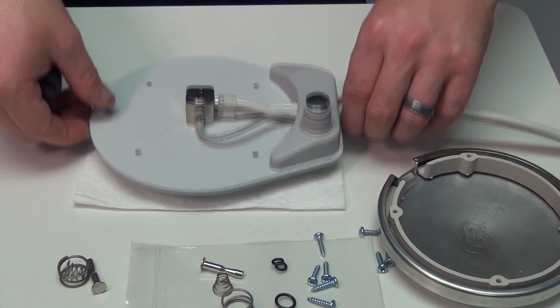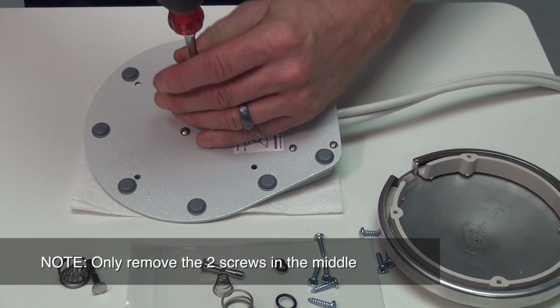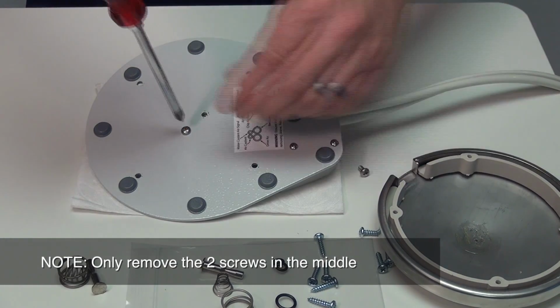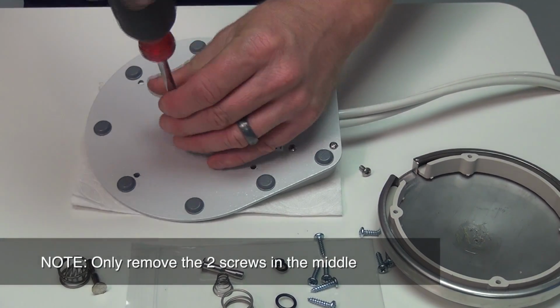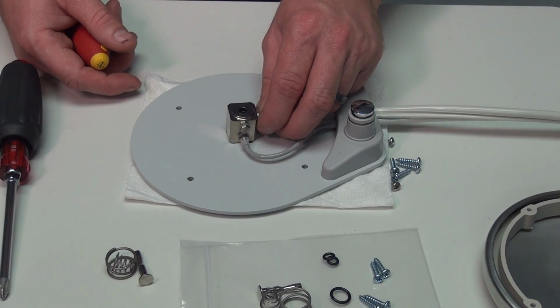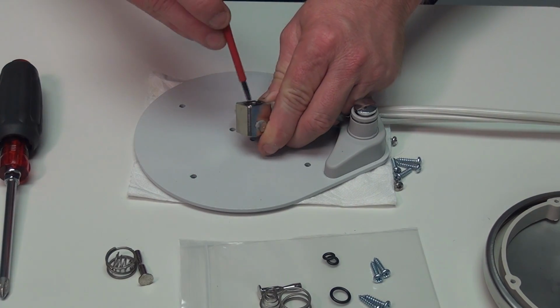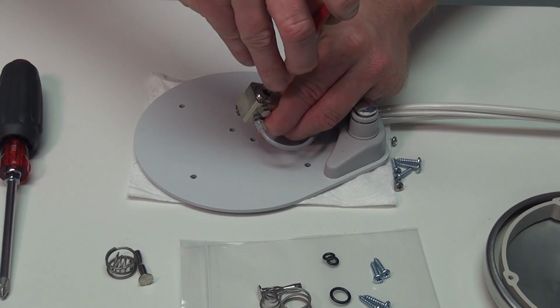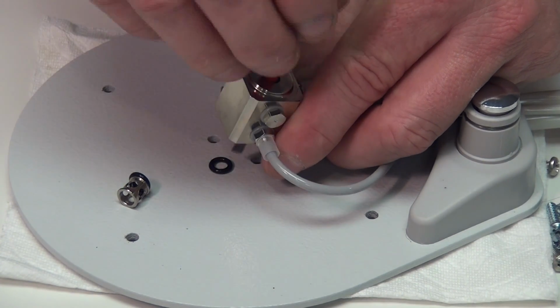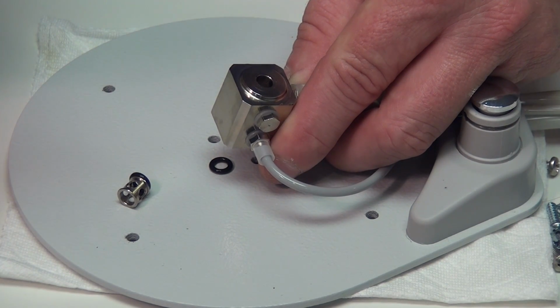Next, flip the foot control back over. Remove the 2 Phillips screws in the middle of the foot control. Once the foot control is flipped back upright, we need to pop out the center barrels. You can do that by slipping a screwdriver down inside the hole. You can use a small flathead or something similar.